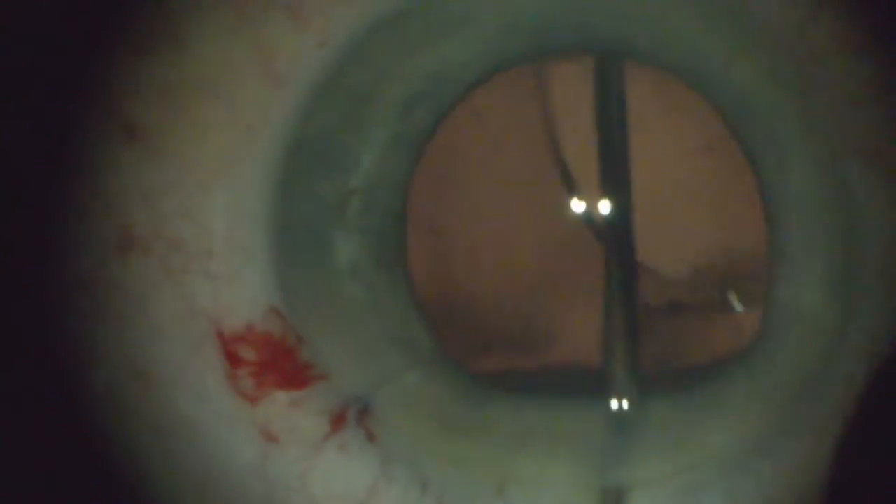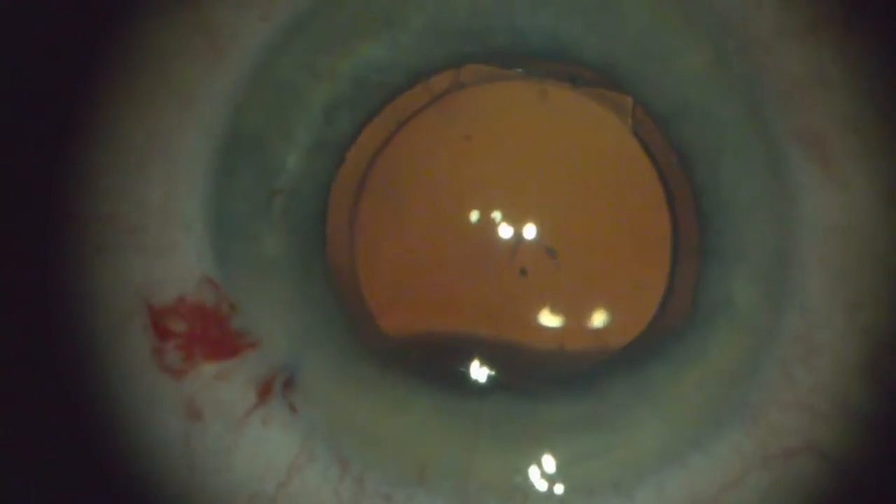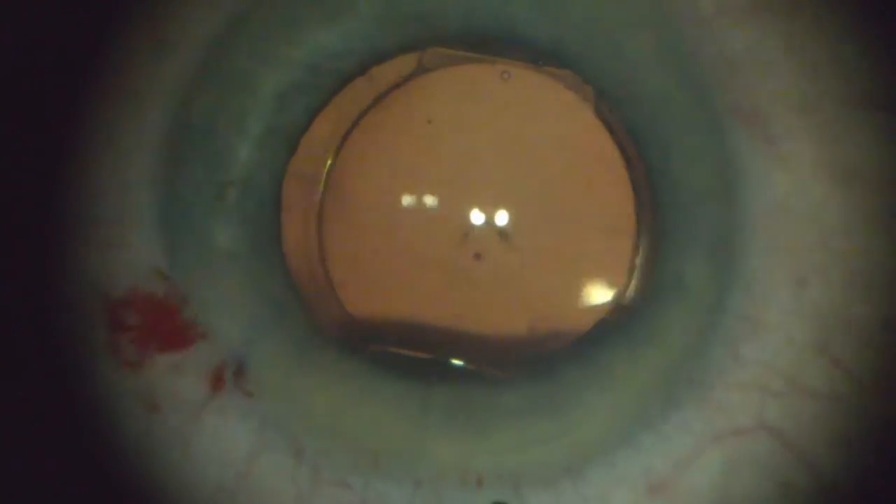Now I know it's in the bag, and if it does not center well, you know it's not in the bag. So I try to rotate it, sometimes 360 degrees. I also polish the capsule, but I'll just show here quickly how nicely this lens centers.